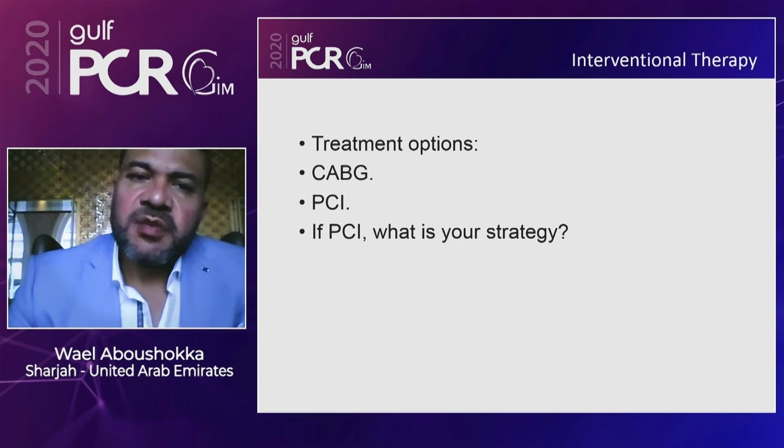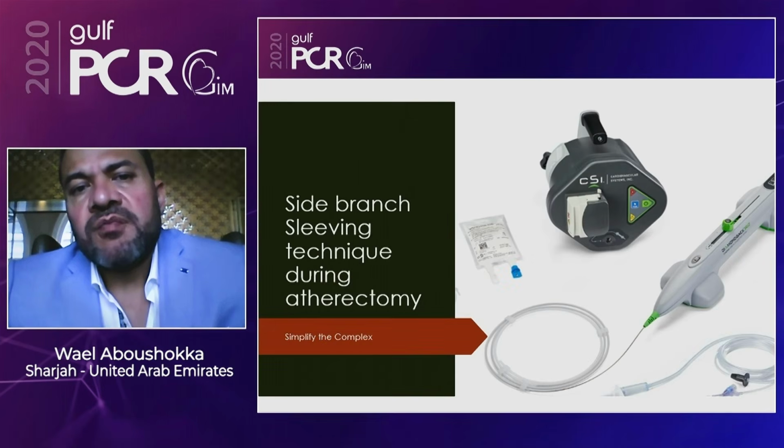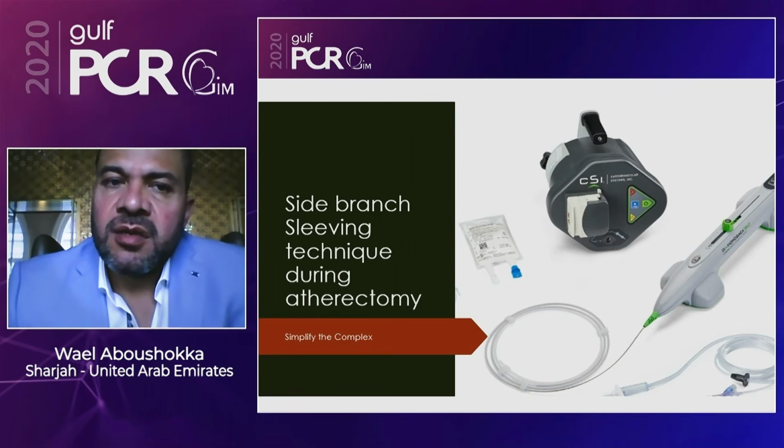So for the PCI, what is the strategy for a long calcific lesion? We decided to go for a new technique to protect the diagonal. It's called the sleeving technique, that we will discuss in detail throughout this presentation.